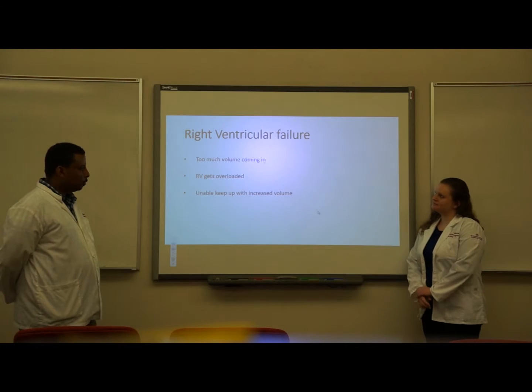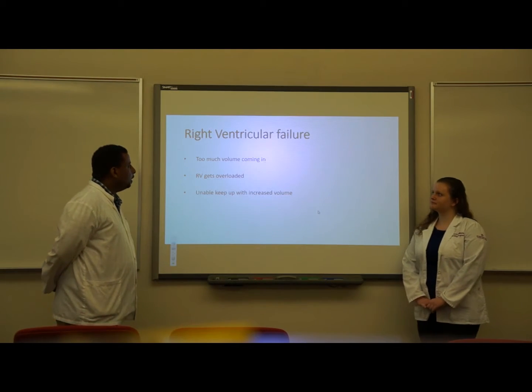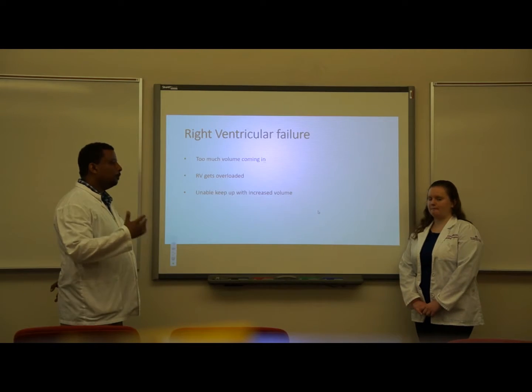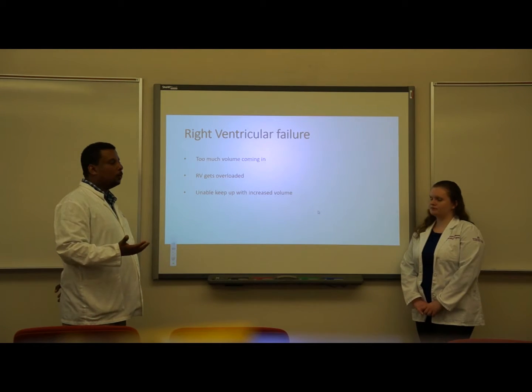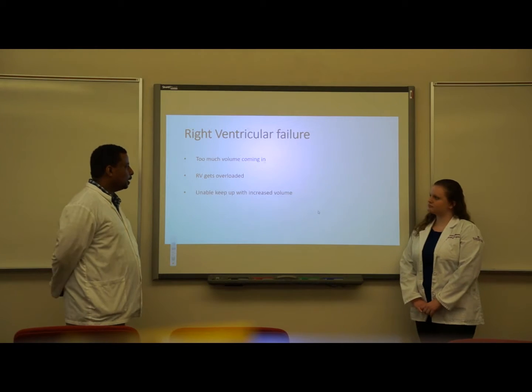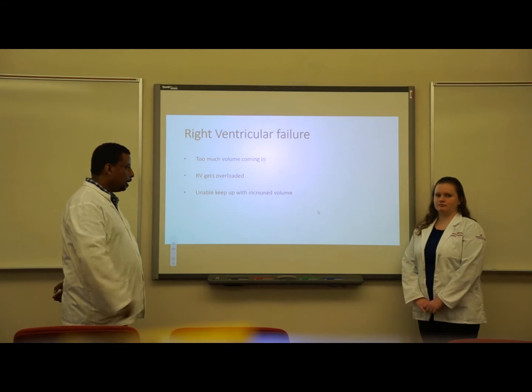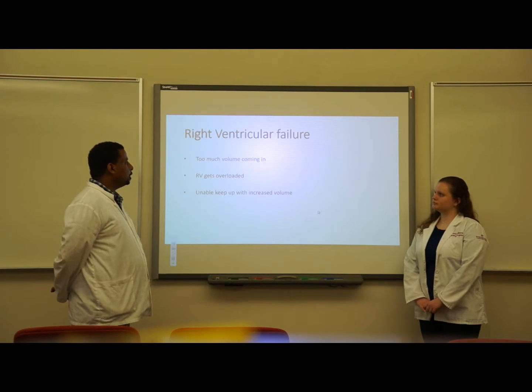All right, so the second complication we talked about is right ventricular failure. It happens because we have fixed the left ventricle. Now we have too much volume coming to the right ventricle, but the right ventricle is not able to effectively pump that into the pulmonary circulation.